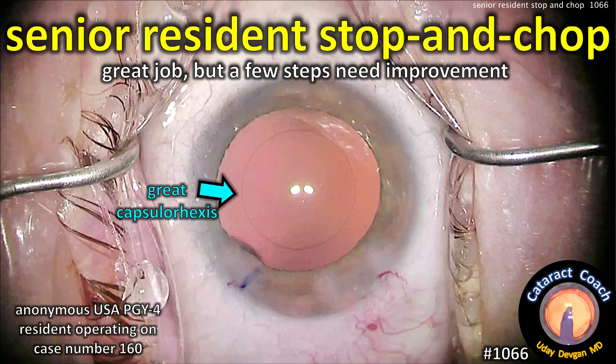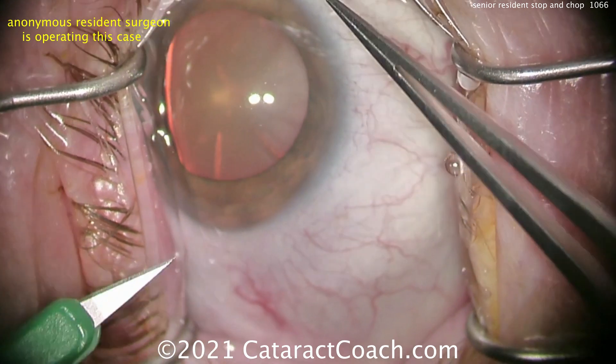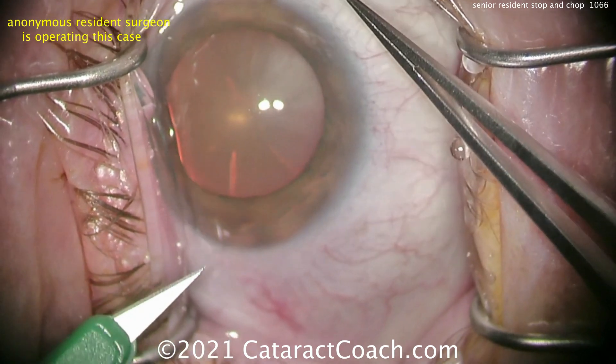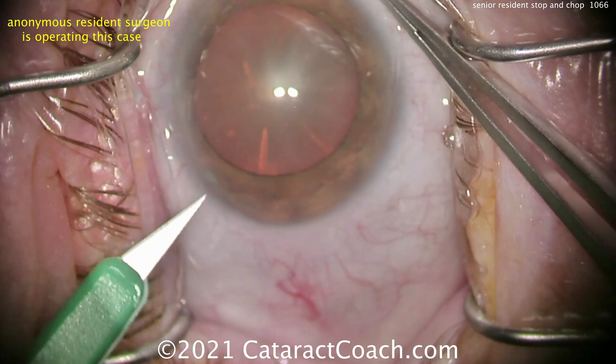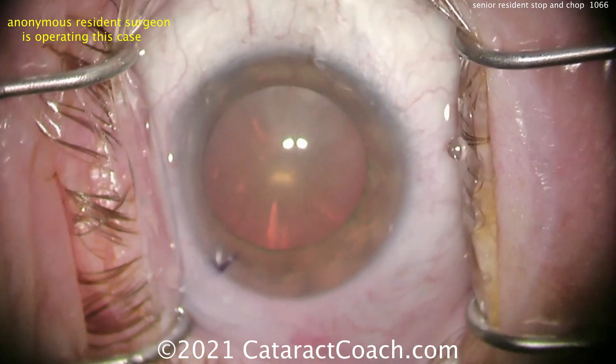CataractCoach.com. Senior resident stop and chop. This resident does a great job, but a few steps may need improvement. We have an anonymous PGY-4 resident — that means postgraduate year 4, or the last year of ophthalmology residency here in the USA — and this resident has done about 160 cataracts so far.